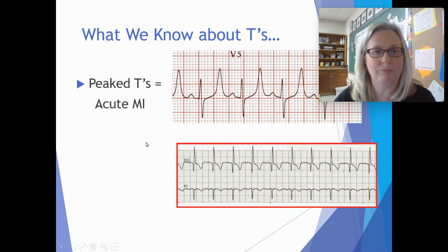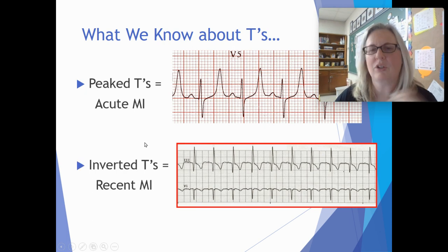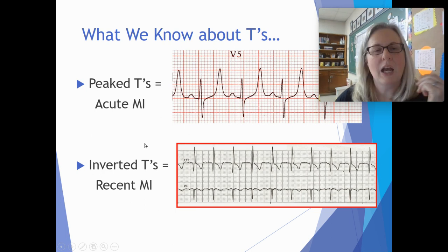It's happening right now. Inverted T's typically mean a recent MI, also ischemia, but can mean a recent MI, meaning it just happened yesterday or 2 days ago.